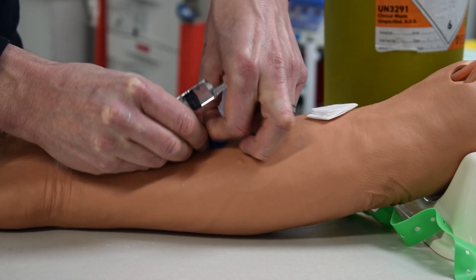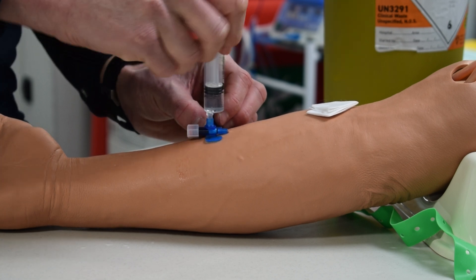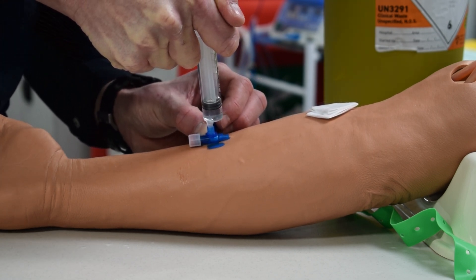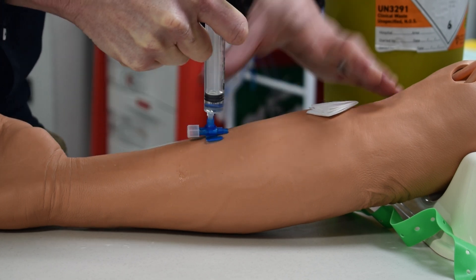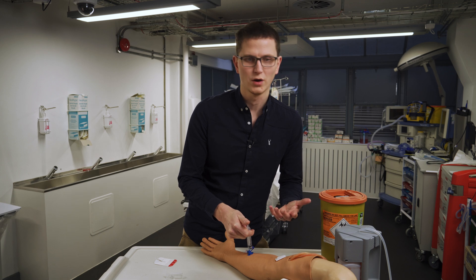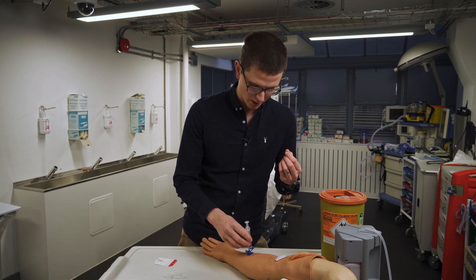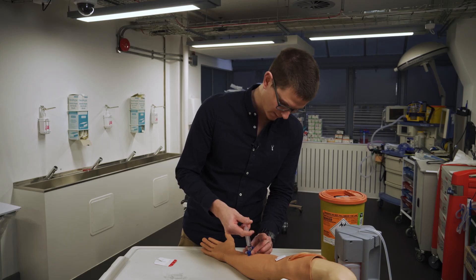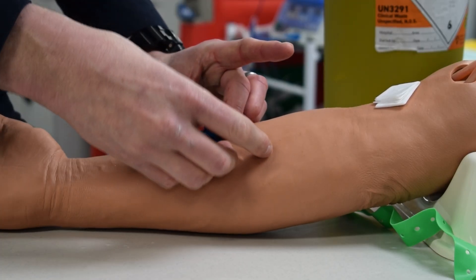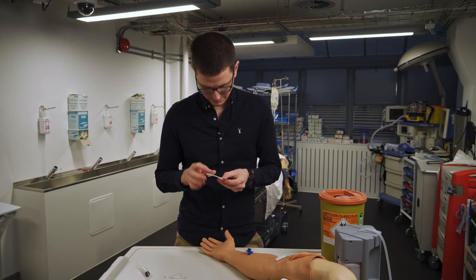Our IV line is now in. We take our flush, pop open the cap at the top, insert it, and push. We pause and wait, looking for any swelling or bulging. If it swells or bulges then we've burst the vein or gone through into the tissue — that's not what we want. Now I know I'm in the vein, I can keep flushing a little bit more. We are definitely in.